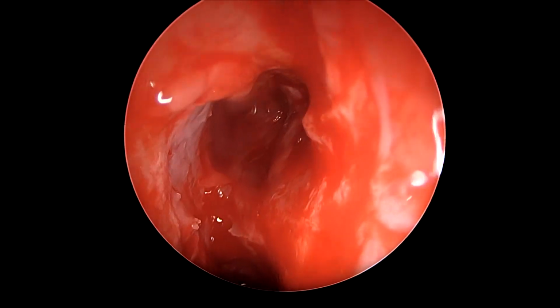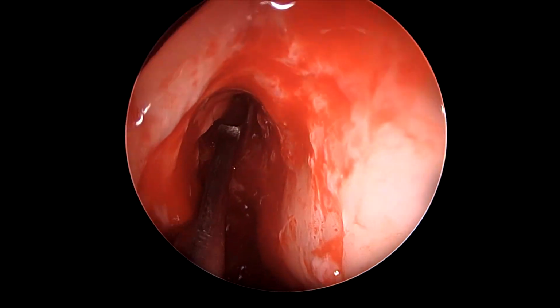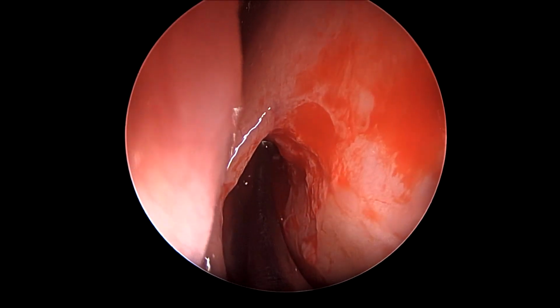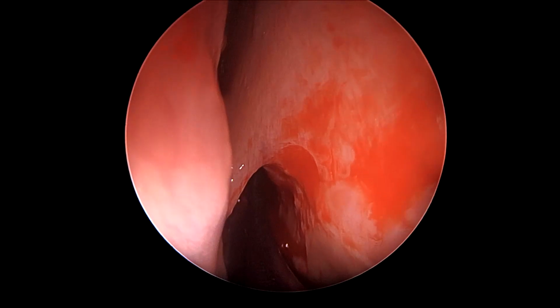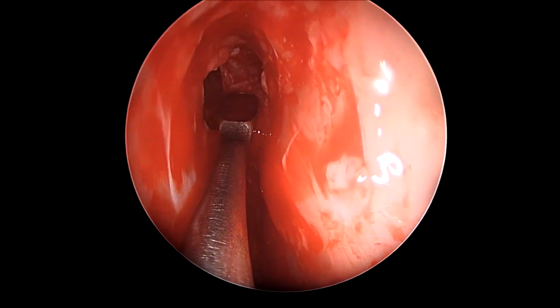Now, as we get a view inside the frontal sinus, we still have to conclusively see if the cell that was blocking the sinus per se, the bulla cell, has been removed or does it still remain? So for that, once again, we resort to using a frontal sinus curette to fracture any cell that still remains inside the frontal sinus and to be able to get a clear view of the whole sinus itself.